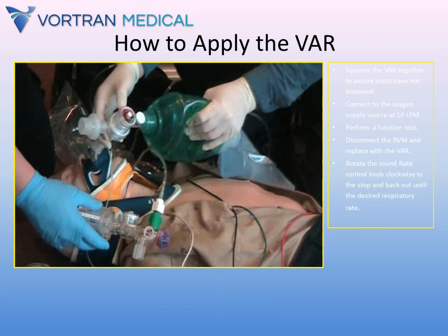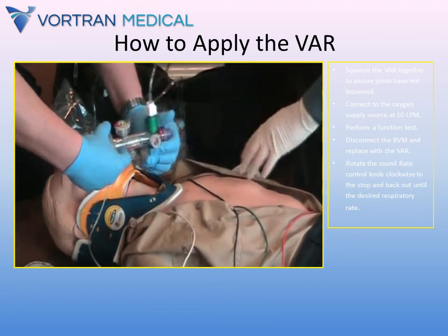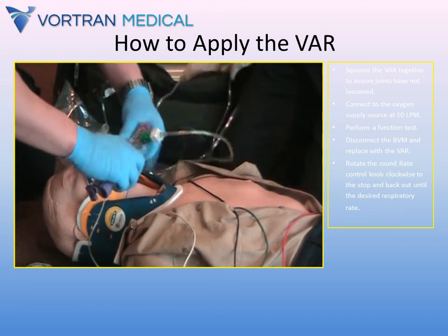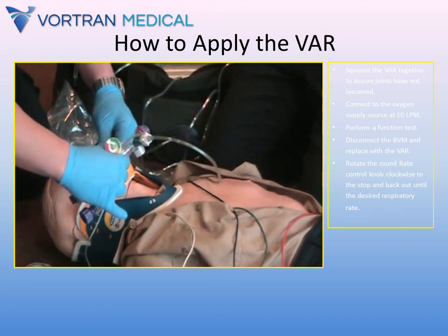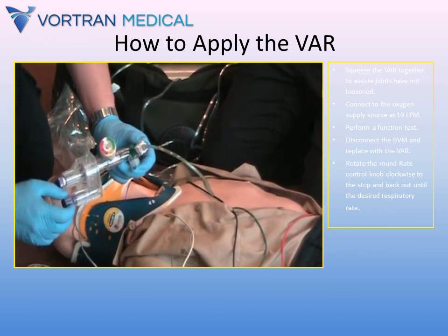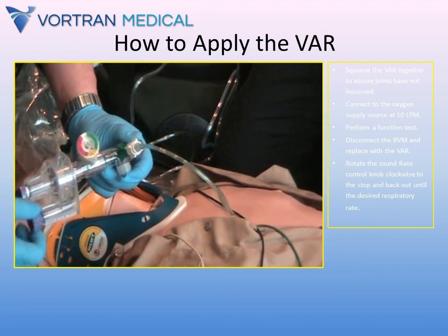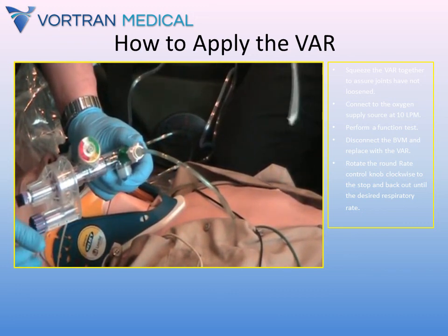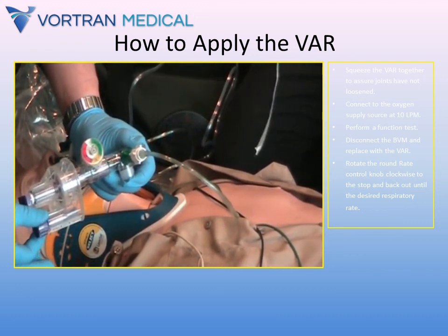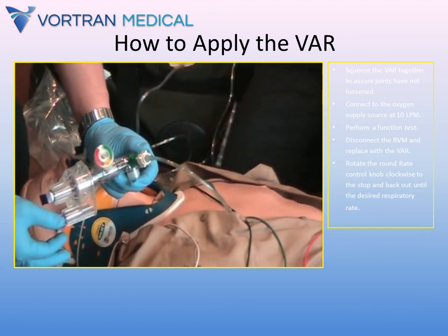Get ready to remove the bag. Okay. Tighten the VAR all the way. And then loosen until we begin cycling. There we go.